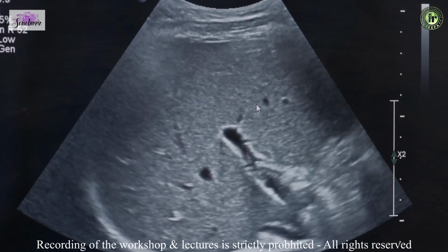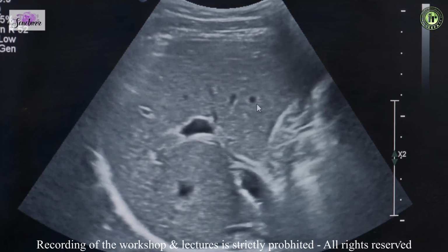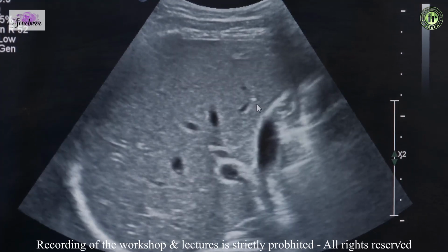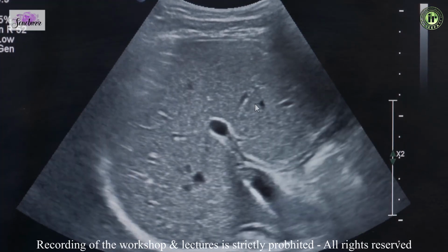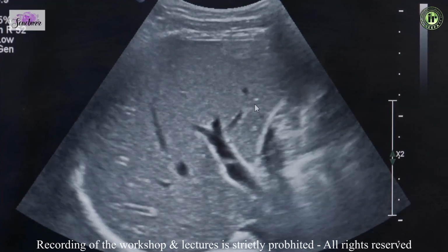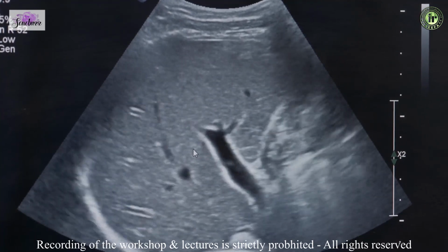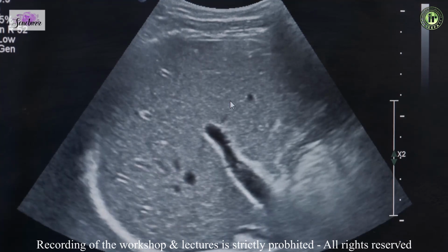Now moving on to taking our elastography reading. Like I said, we have to be within the intercostal space, and one of the common questions which pops up is, where do we take our reading? So as per the SRU guidelines, we can take it anywhere between segment 5, 7 and 8.